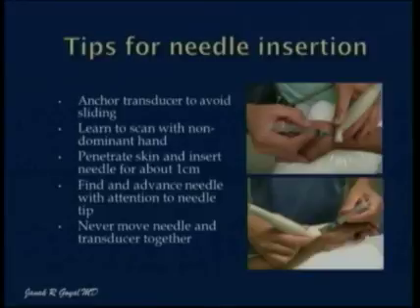In a nutshell, the tips for needle insertion: you must anchor your transducer to avoid sliding. You must make sure that your transducer is very steady. Learn to scan with a non-dominant hand. Penetrate skin and insert the needle for about 1 centimeter before you advance it.